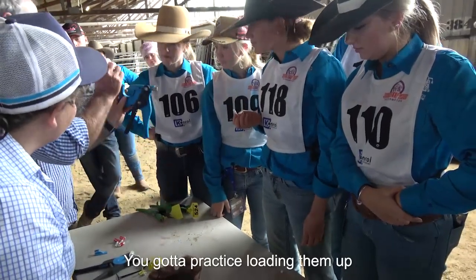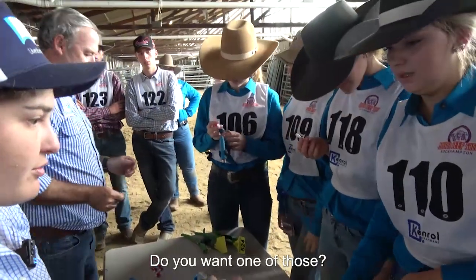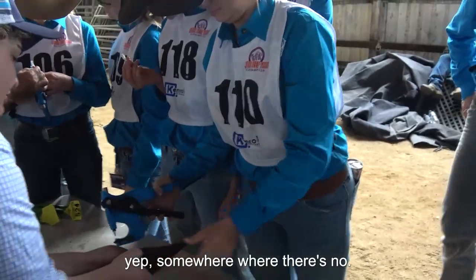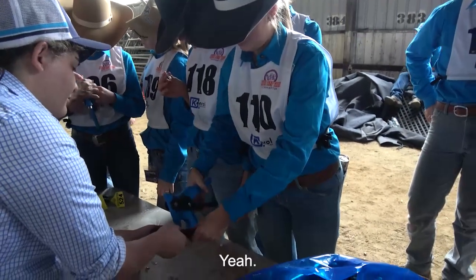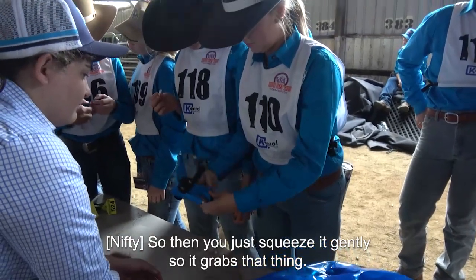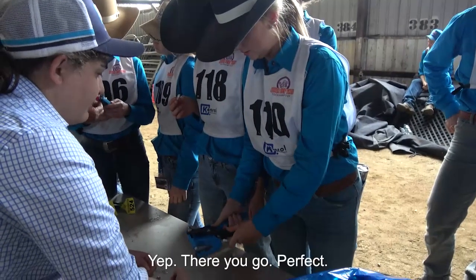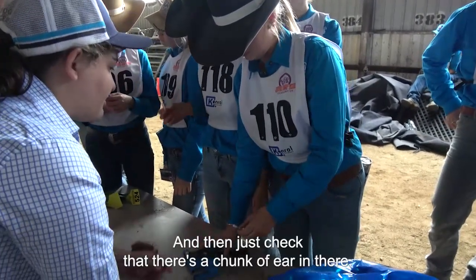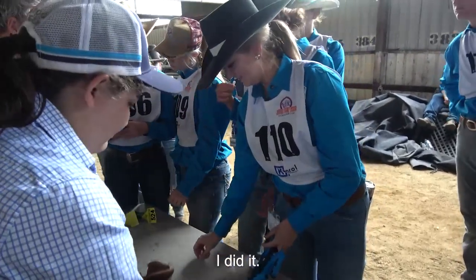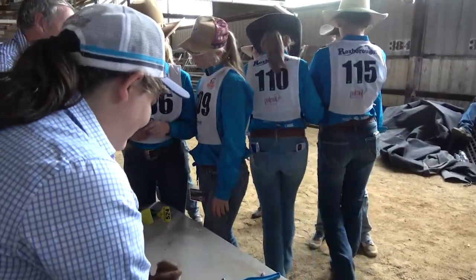You've got to practice loading them up. Open it up somewhere where there's no hair. Squeeze nice and hard, that's perfect. Then you just squeeze it gently so it grabs that white thing. Take out those two safety pieces, pull them apart, there you go. Then just check that there's a chunk of ear in there. Done. Awesome. Who's next?